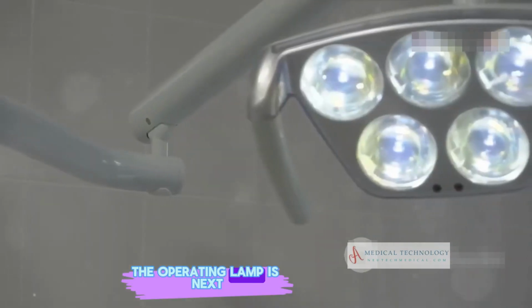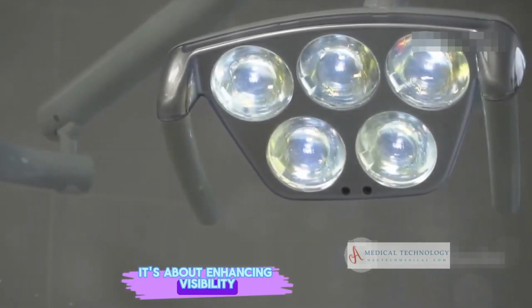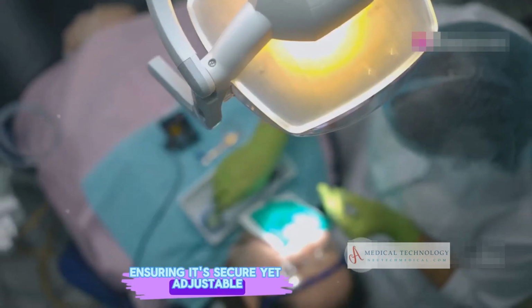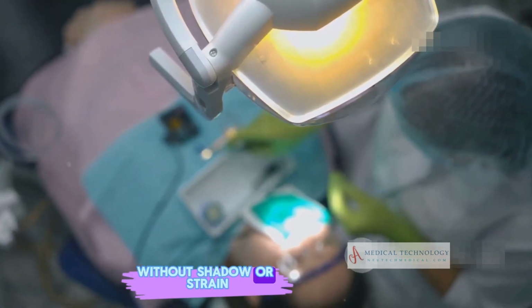The operating lamp is next. This isn't just about shedding light, it's about enhancing visibility for precision in dental procedures. Attach the lamp to its arm or bracket, ensuring it's secure yet adjustable. Properly positioned, this lamp will illuminate every procedure without shadow or strain.